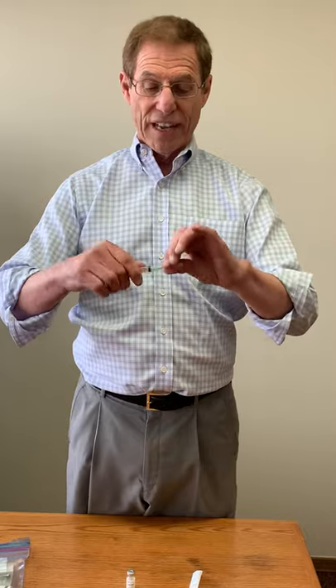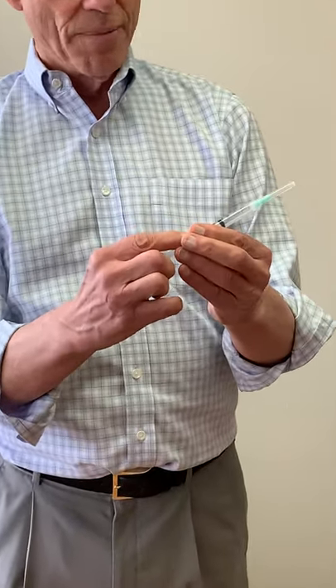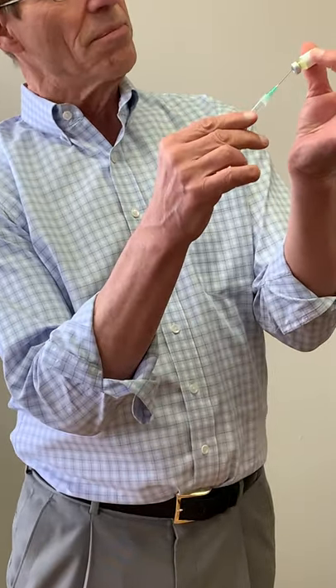We take our 3cc syringe and attach the larger needle, which is the 21 gauge, just like that. I like to pull the plunger back to two, because we're going to be taking two cc's out and it's just easier if you do it in a vacuum. We'll be taking it out in a back-and-forth motion, so I put the needle in the middle of the rubber.